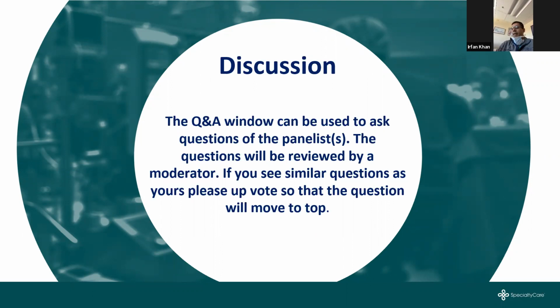And then the other piece is, I think a lot of people get focused on the RV per se, but you have to remember that the LV plays a very important part in that, and you have to make sure that there's no LV dysfunction. And one of the ways of doing that is to know what your LV pressures are. And I think if it's becoming doubtful as to why you're having RV failure despite protection and despite having decent saturations, despite having decent flows, and you're still running into trouble and you feel like the RV is not doing well, you may want to look into the LV, because if your LV EDP is high, then that may be the other problem that you're dealing with.